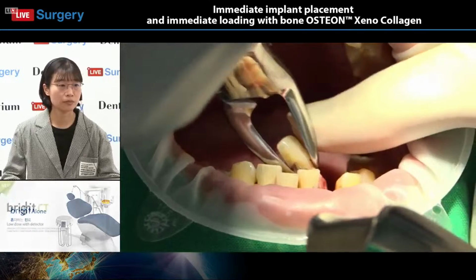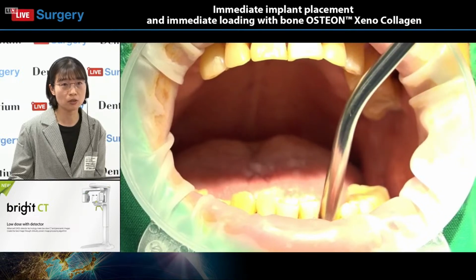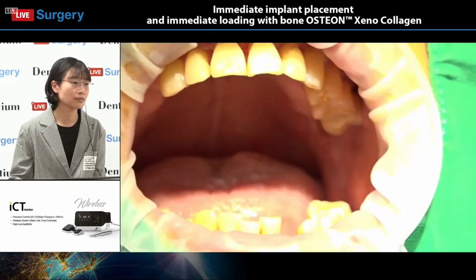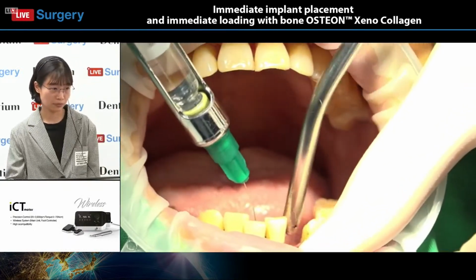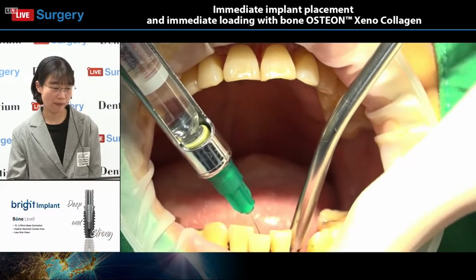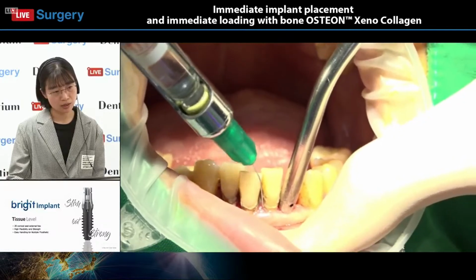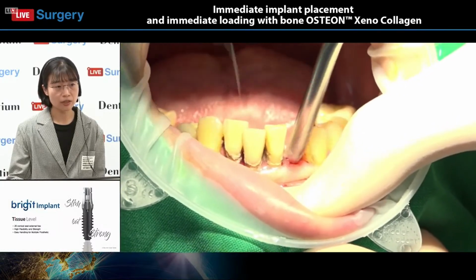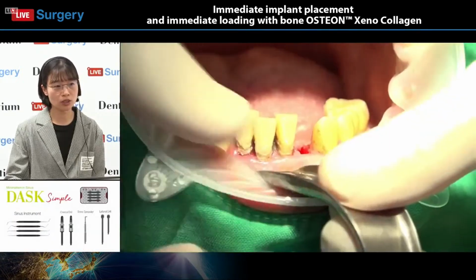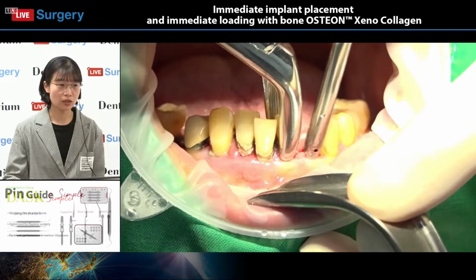Now he is doing the tooth extractions on the lower anteriors. I think he needs more anesthesia because of the bleeding due to the severe inflammation. We can imagine there is much granulation tissue inside the gingival flap.